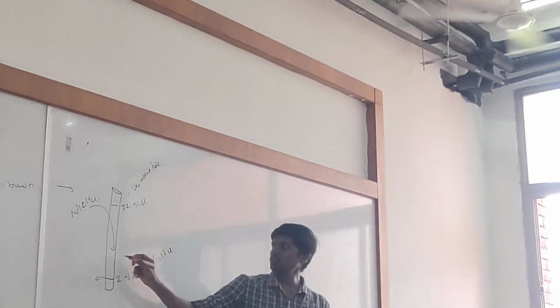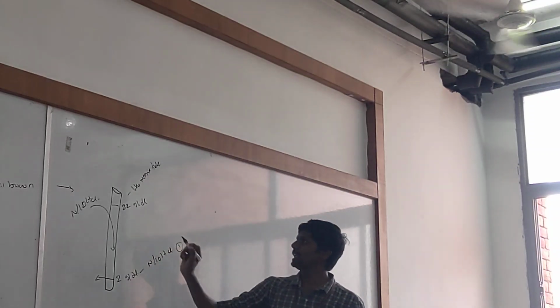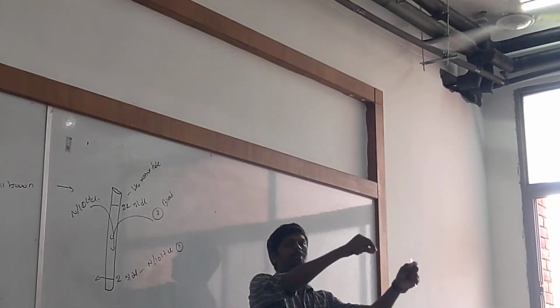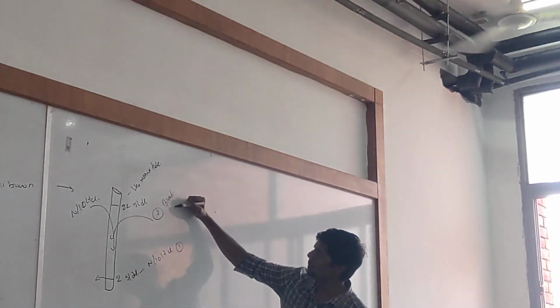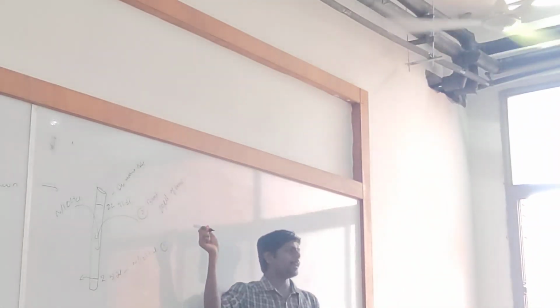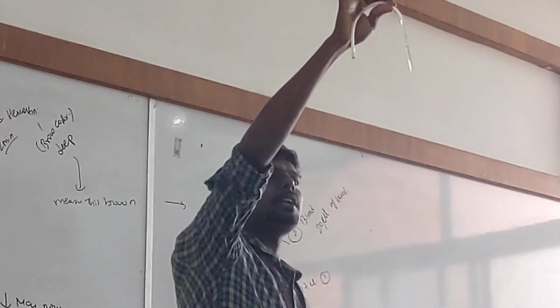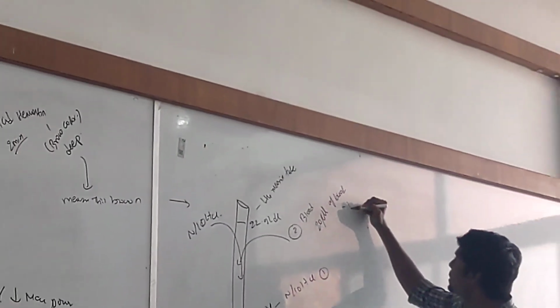Next, to this we will add a specific amount of blood. This is the first step. Then the second step, we are adding blood to the tube. We are not going to add random drops of blood. Rather, we are adding a specific quantity of blood, that is 20 microliters, to the acid. For this purpose, he developed a standard pipette, called the HB pipette.